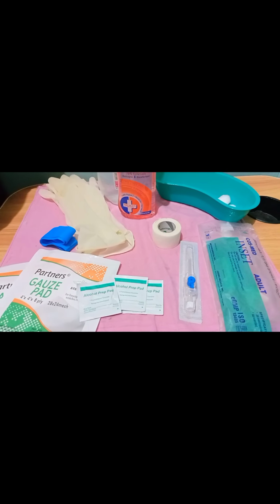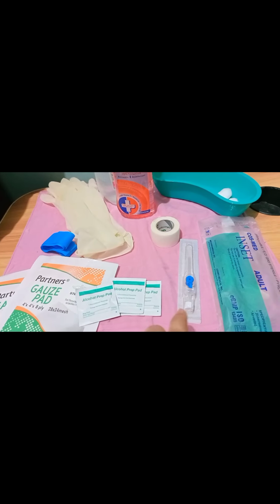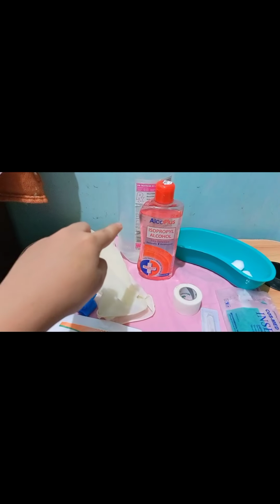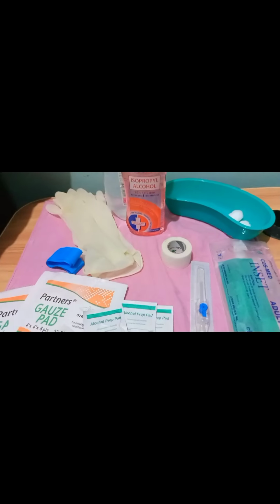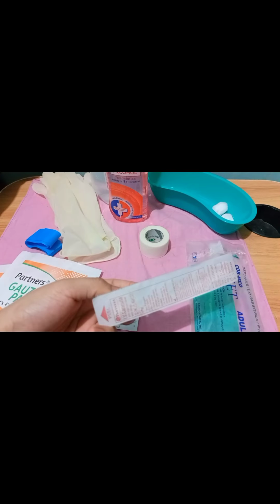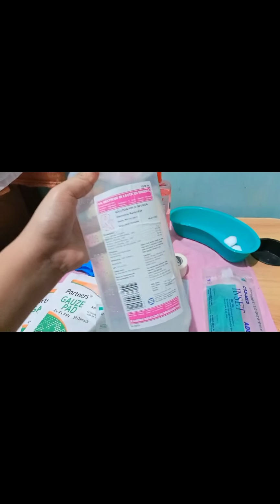So here is the equipment I prepared. I have gauze pad, alcohol swab, IV cannula with 22 gauge, and then IV set, surgical tape, tourniquet, disposable gloves, alcohol, IV fluid, then kidney basin with cotton balls with alcohol and dry cotton balls. So check for the sterility and integrity of our materials. Check the expiration date. Here, it's 2023. Our IV cannula expiration date, 2024, and this is our IV fluid.